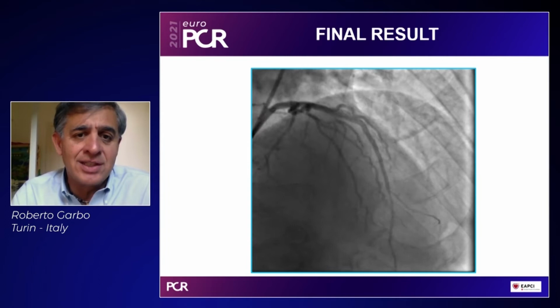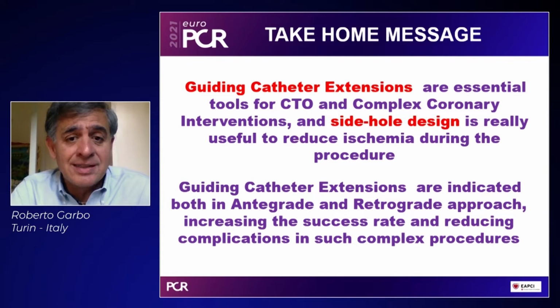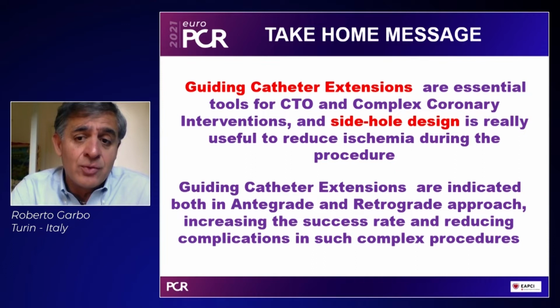So to conclude, guide catheter extensions are really essential tools for CTO and complex coronary intervention. And the new side hole design is really useful to reduce ischemia during this kind of procedure. And the guide extensions are indicated both in anterograde and retrograde approach, increasing the success rate and reducing the complications in such complex procedures. Thank you very much for your attention.